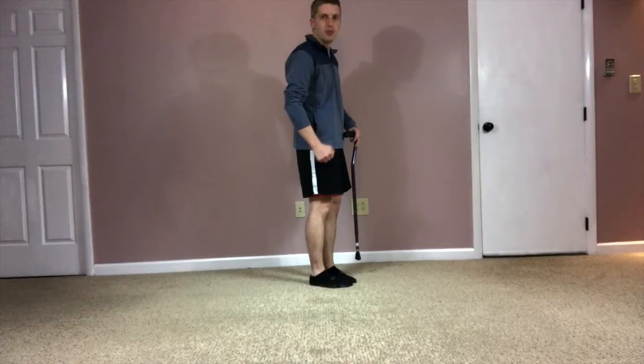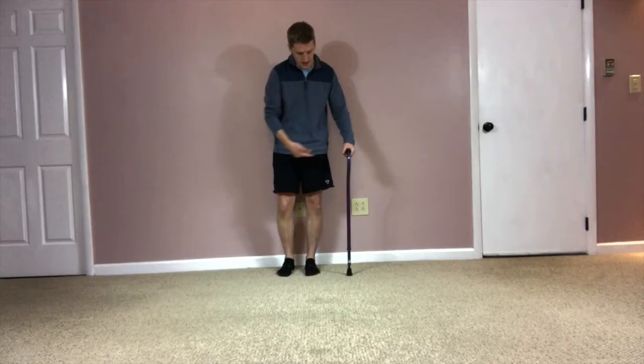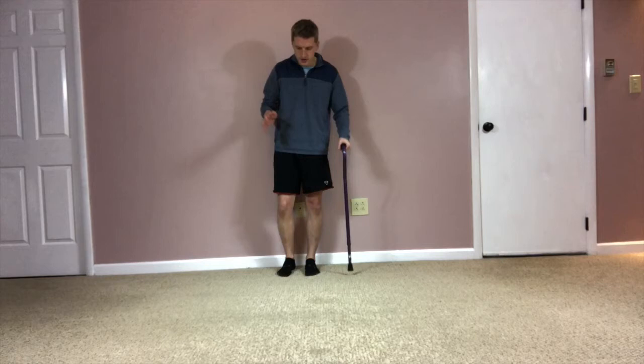A lot of people hold the cane on the wrong side. They'll put it on the same side as the side that they had knee replacement surgery. Actually, you want the cane to be on the opposite side of the side you had surgery. The reason for this comes down to physics and some moment arm and mathematics. I won't get into it here, but just trust me, you want it on the opposite side. It's going to provide more support when you're walking.